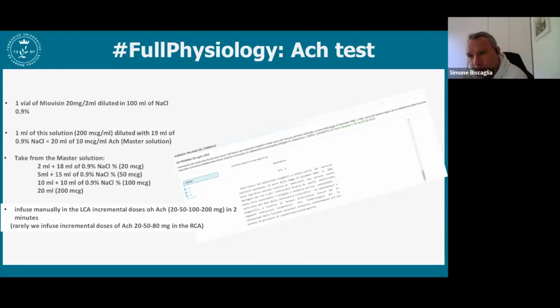We had 2 cases with atrial fibrillation, but we did more than 100. So it's, I think, a very, very low percentage of patients, and it was not sustained in one case. So it was like 2 minutes or 2.5 minutes. In the second one, we had to perform the bolus with amiodarone, and then it was okay. And no other major complication.